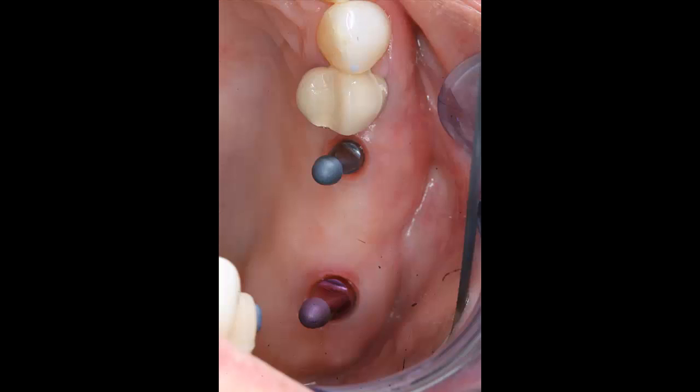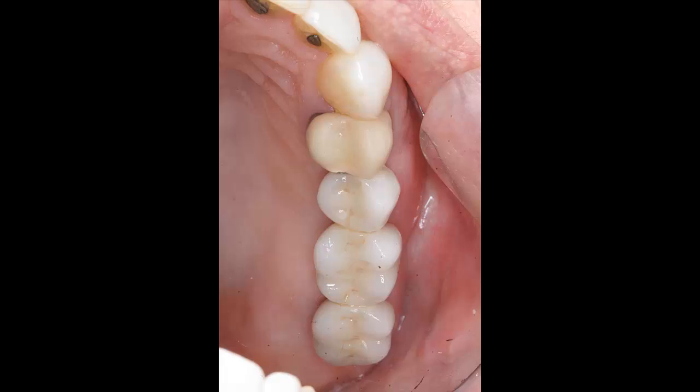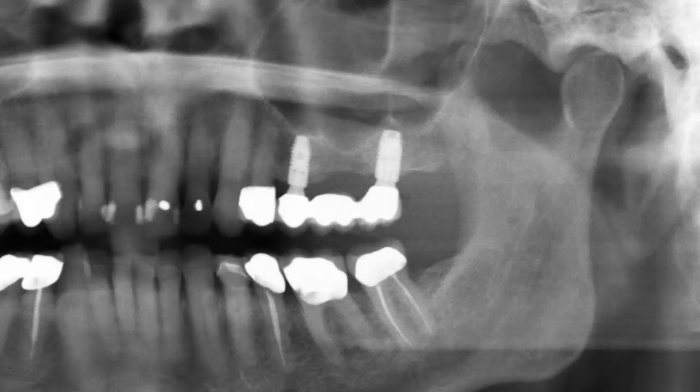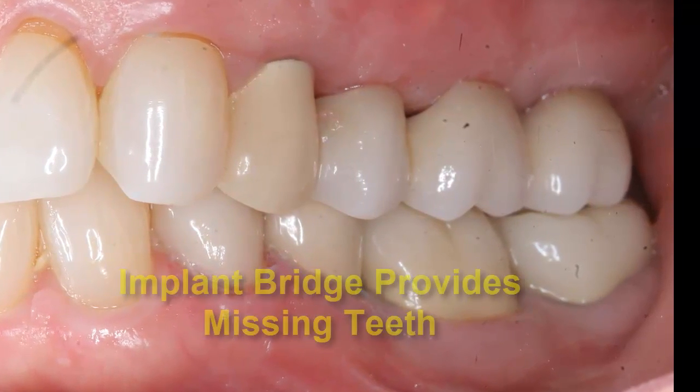In this case, laboratory-produced posts and a cemented porcelain-fused gold bridge was connected to the implants. A beautifully functional and aesthetic result was achieved for the patient, and she was overjoyed to have her teeth back again.